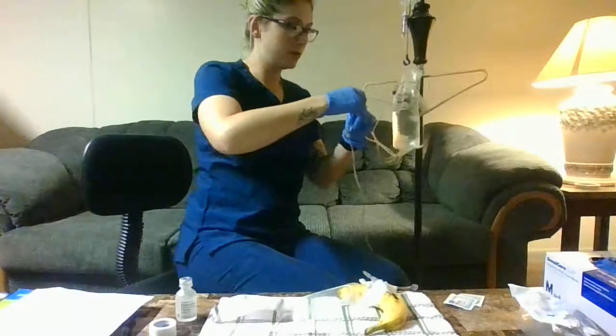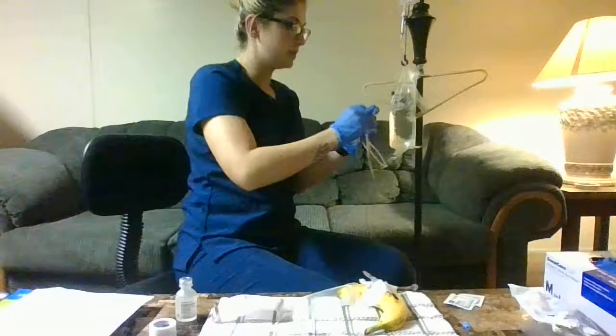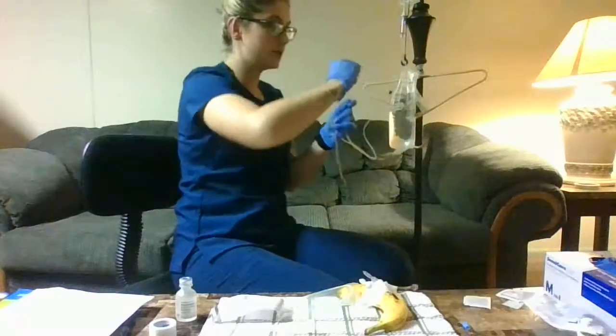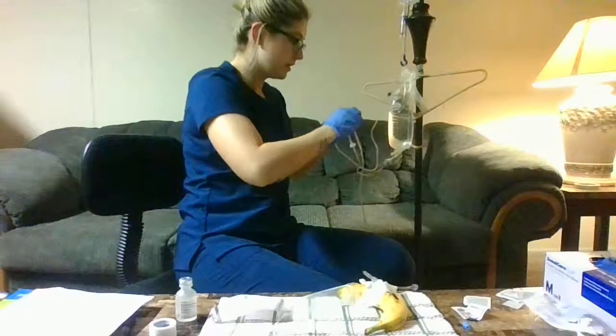Going to remove the part here. We're going to clean both of them. New one, clean the top of the other one, and then we are good to hook them together.